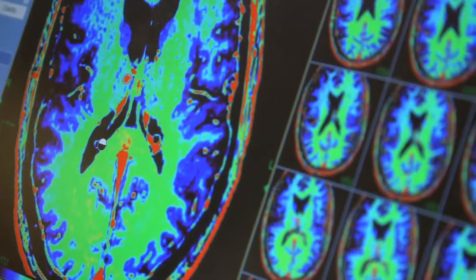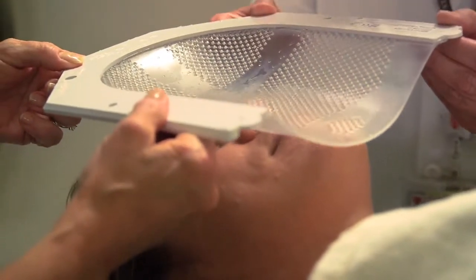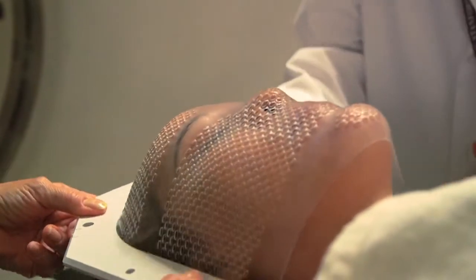Now we could actually treat formerly untreatable conditions. It's the idea that one should do surgery in the least destructive way possible. CyberKnife in itself represents one of the major advances in medicine over the last 50 years.